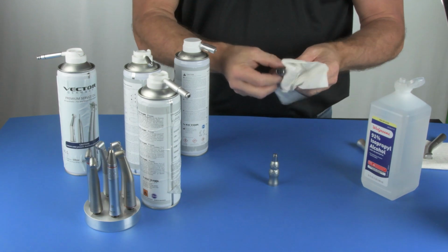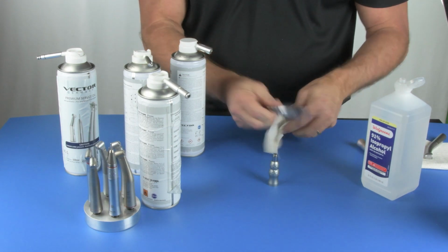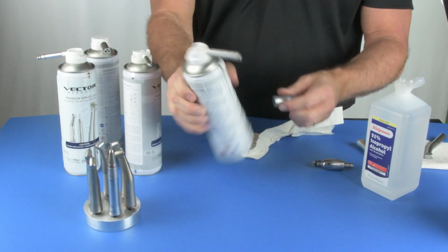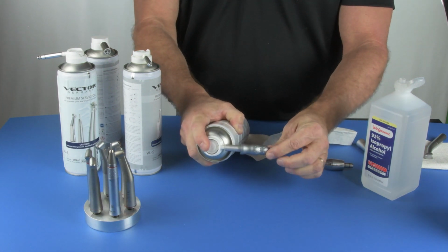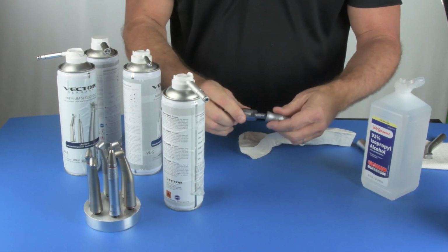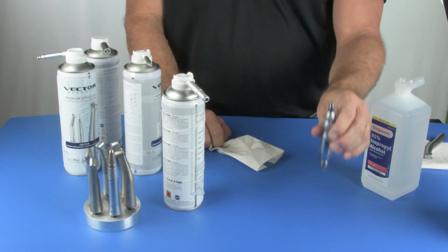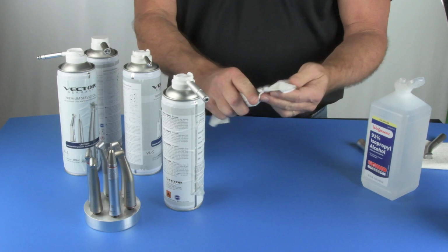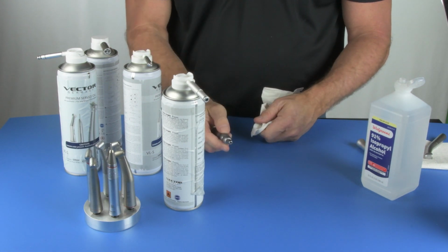Wipe off the exterior of the handpiece with an alcohol 2x2 to remove any exterior oil. Take the nose cone and use an E-type adapter on it. Now that will fit up in there, and you spray it until it runs out clear. You can put that back onto the air motor and go ahead and run the air motor in the operatory or back onto an air station depending on what you have. Once it's done, go ahead and wipe the exterior of the handpiece again with an alcohol 2x2. It'll remove any excess oil, sterilize as needed.